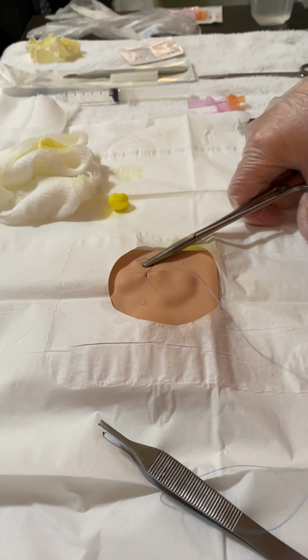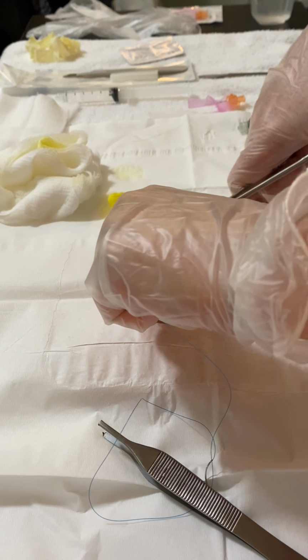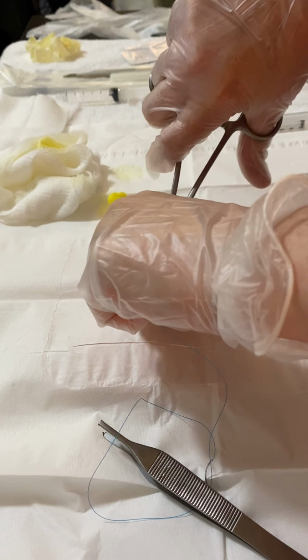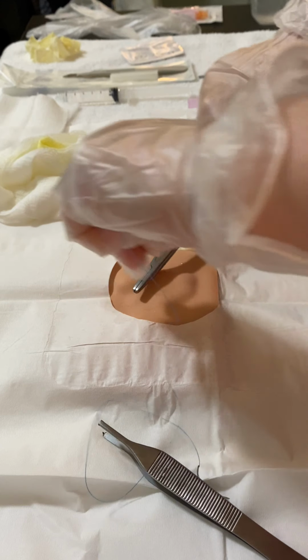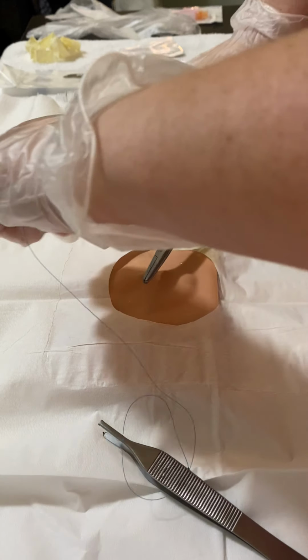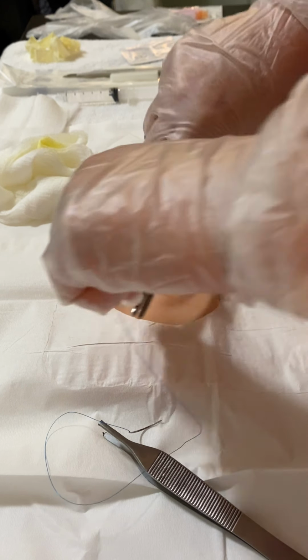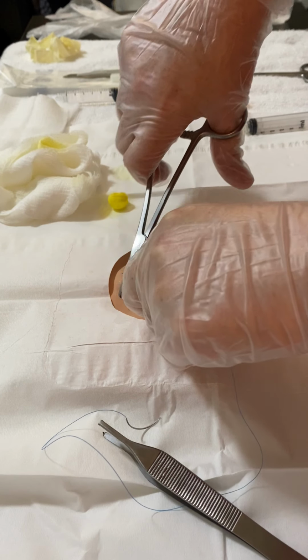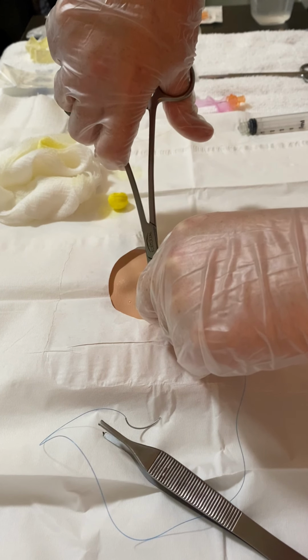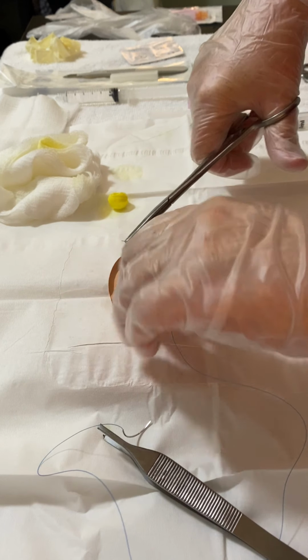Making sure that suture needle is far enough away where there's no danger in cutting ourselves. And then making a couple more passes through to secure the suture.